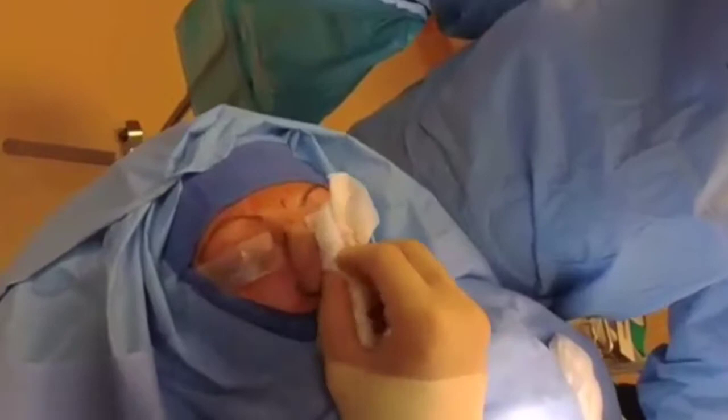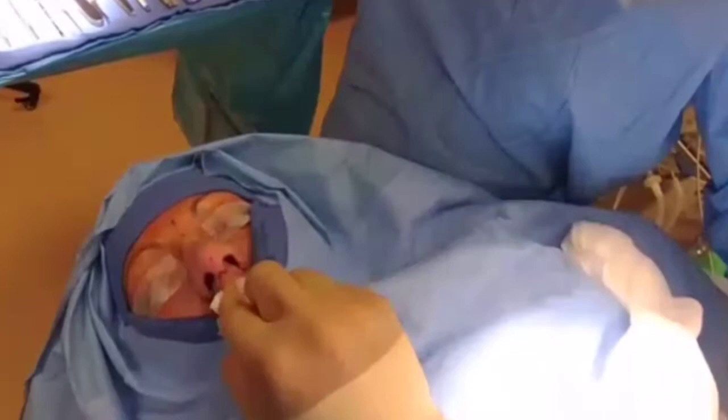We're in the operating room. We put a lot of numbing medication in there, that's why the nose is all full and a little bit wider. We're going to get started with our little incision here.